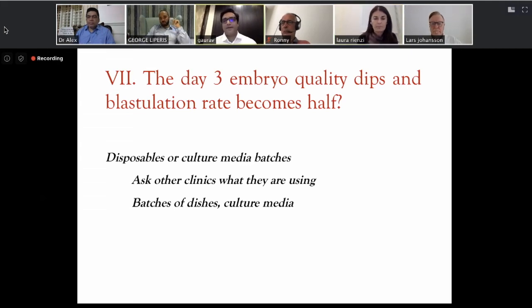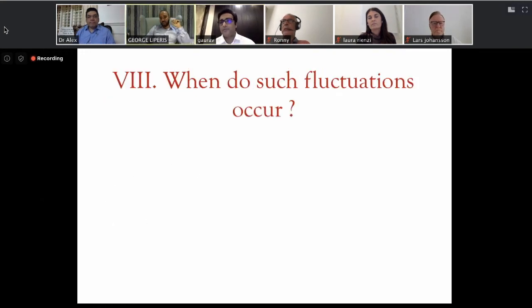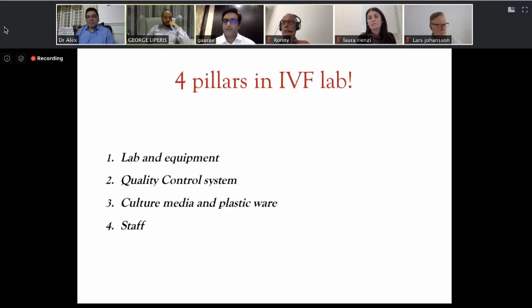So I basically asked you this because we have come across laboratories which are dark and where they're constantly working in very feeble light. So it's great that you cleared that for us. Now, just another input, Gaurav, sorry. Yeah, for the media, it might also be important to test the pH of every new lot that is introduced in the laboratory prior to use. Right. That will help reduce the variation to a great extent as far as culture media is concerned. Yes, that's very important. Check the pH of every batch.